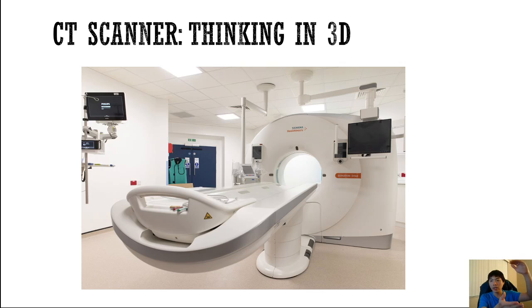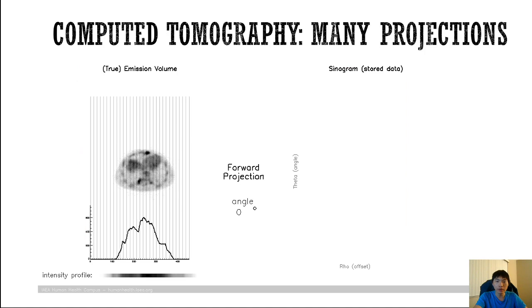It's basically an X-ray generator and a detector, mounted opposing one another on a rotating gantry. And so we can rotate the two together to get our different projections or different angles. So let's have a look at how this works to get an image.